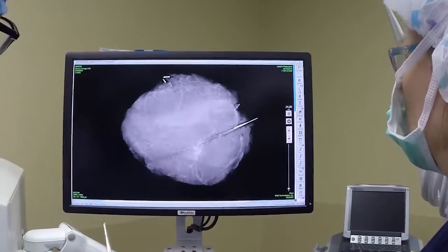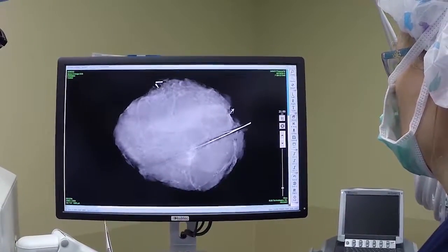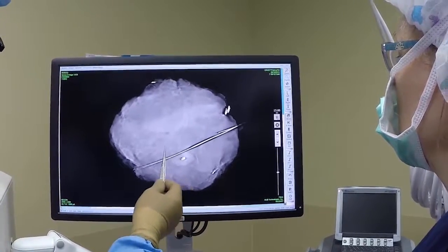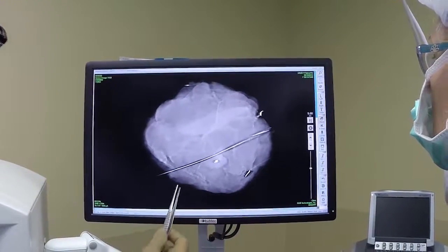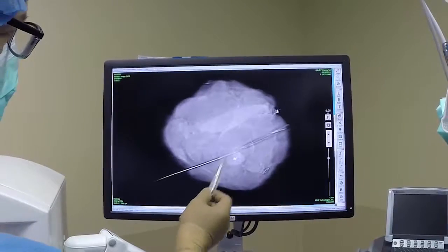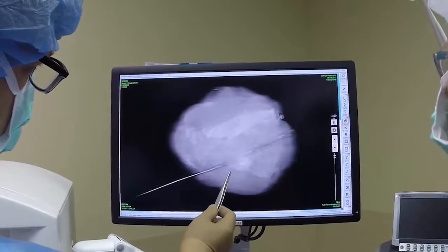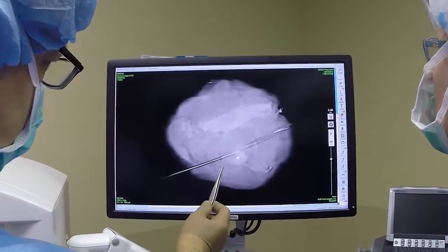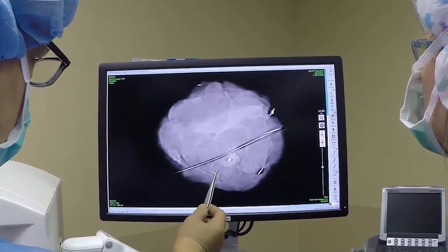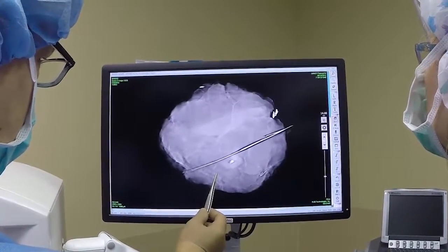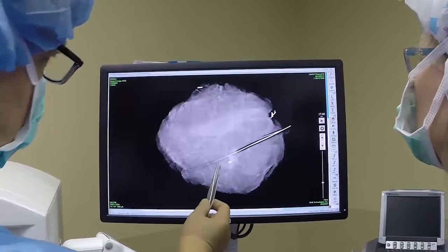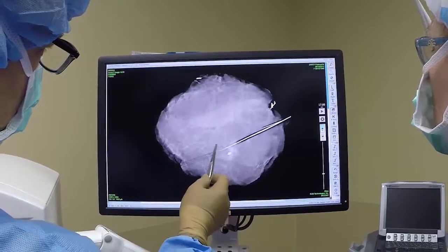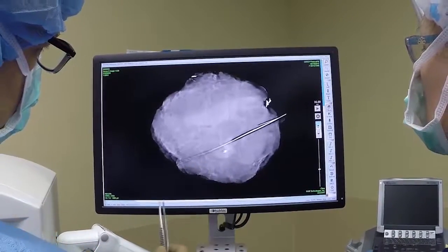That's going away. So, here's our clip. And there's the spiculation with some lines. So, when it comes back again — there. Now we can move it up one or two. This is my view with the spiculation here, and I can window it in a minute.